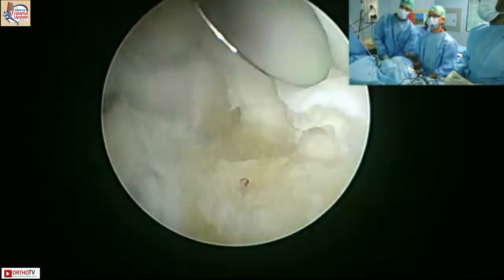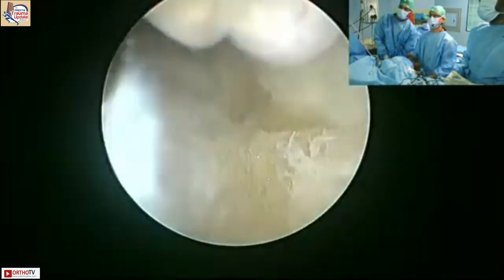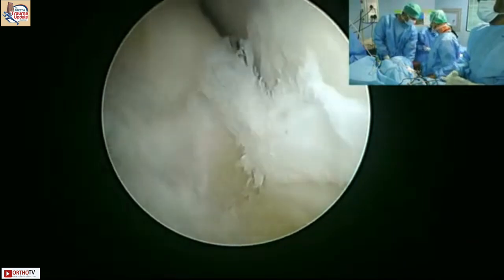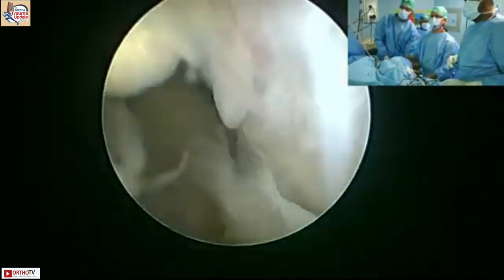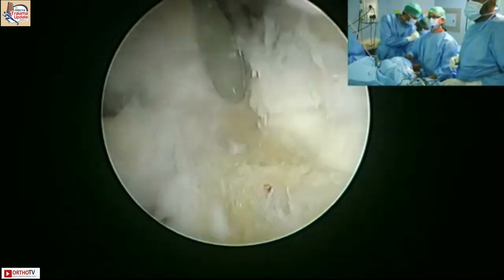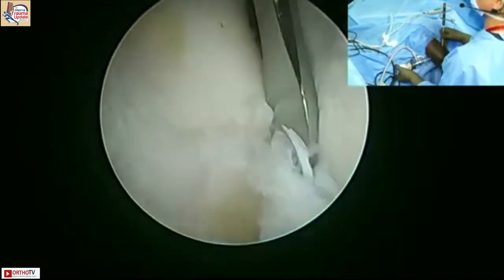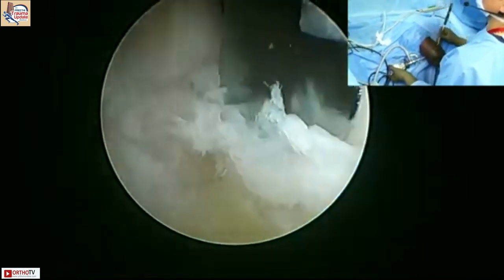Difficult part. Okay. Yeah. Give me the other one. And you can also do a capsular release with these. So this is what I'm interested in taking off. But even if I left this, it will not cause a lot of problem because it is only cartilage. It'll eventually just dissolve because it does not have bony support.